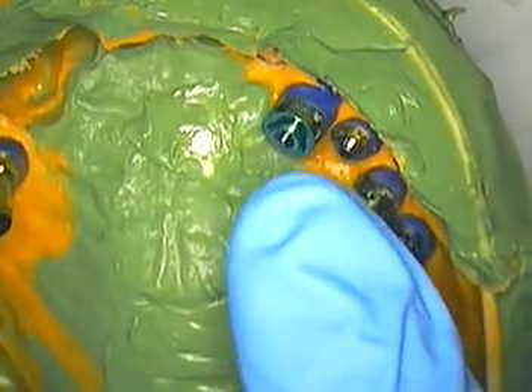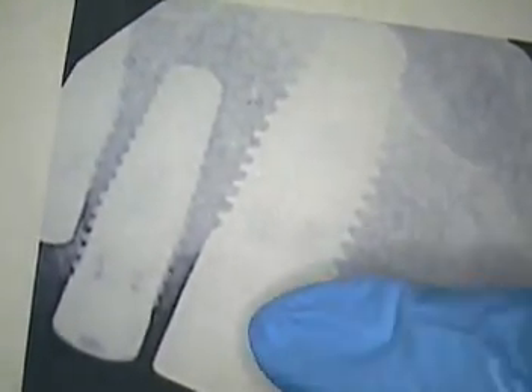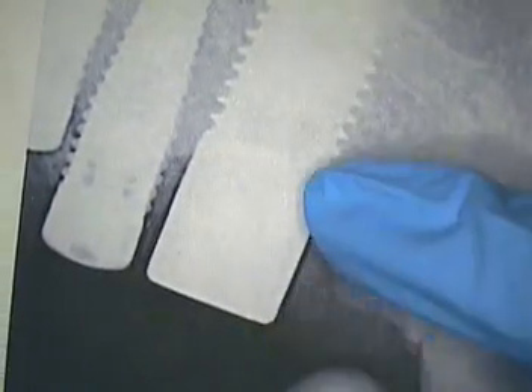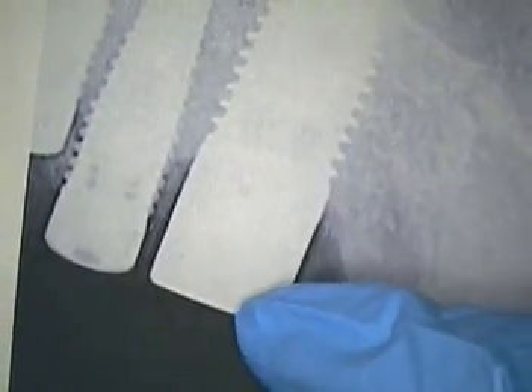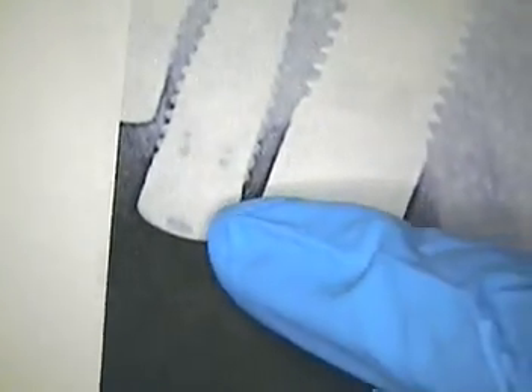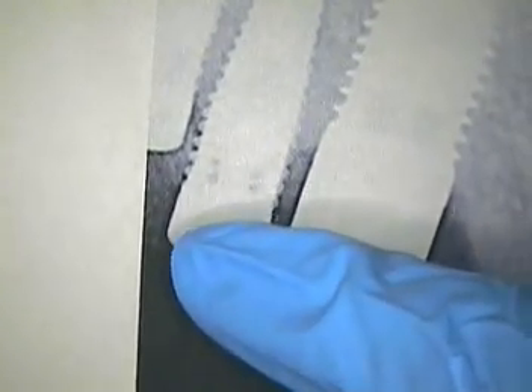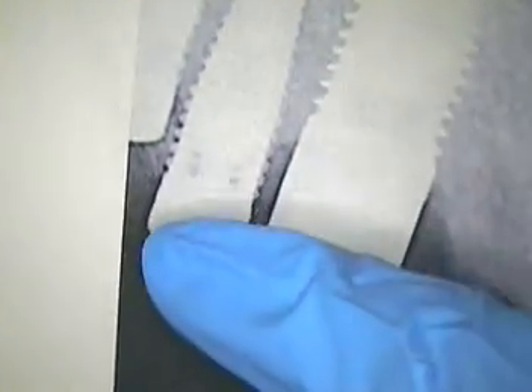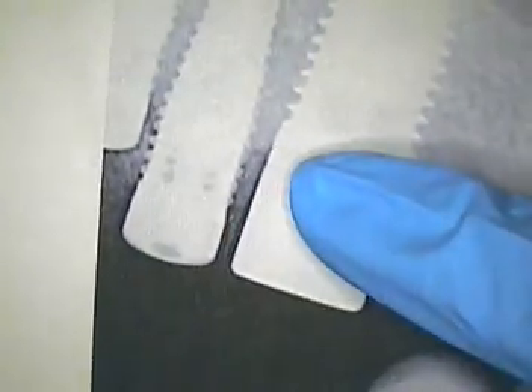I want to say implant number six because, as you recall, it was a kind of a deep countersunk implant. This is the x-ray of the implant itself, and of course it has a five millimeter collar that comes all the way up from the healing abutment. It's a straight healing abutment versus a flared one. What's next door is also a straight one millimeter healing abutment, so you've got a large change between one and the other.